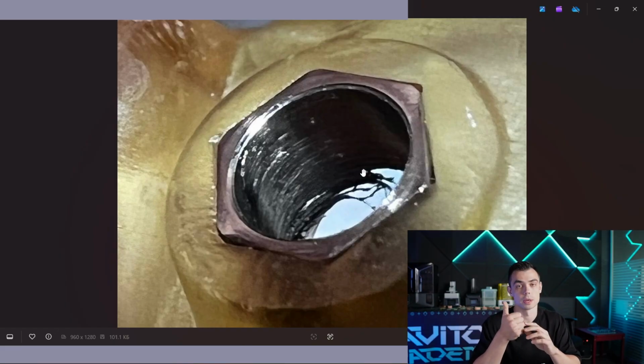The first mistake was made by the manufacturer, because the manufacturer of the sleeves made a sleeve narrower on the seam than it was in the library.